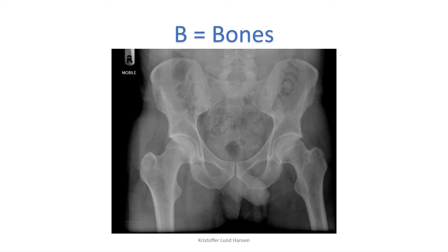Now to B for bones — the most obvious part of a skeleton x-ray. Here you start by tracing the cortical outline of the bones to look for any breakage in this line. You start with one femur and trace the cortex all the way around it, then you do the other femur. Afterwards, trace the pelvic ring for any breakage of the cortical line, then you do the obturator rings, and lastly trace the whole outside of the pelvis itself.